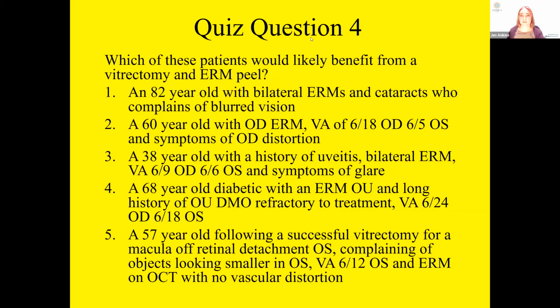So here's our big question. I'm going to put this up and leave it up for a while for everyone to have a good read. This is a clinical one. Have a read and a think. So one answer is much more correct than all the others.